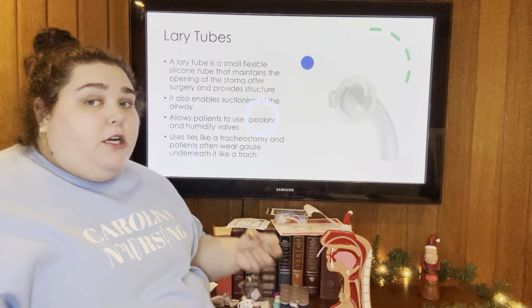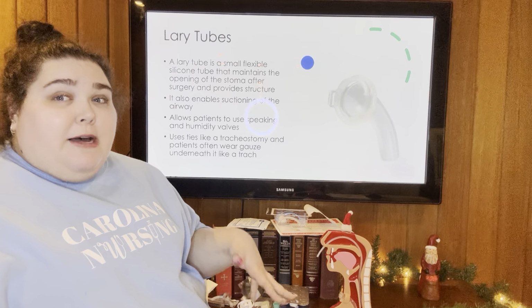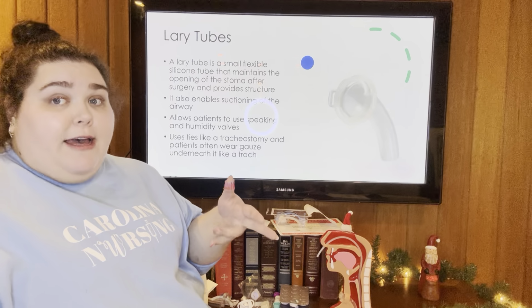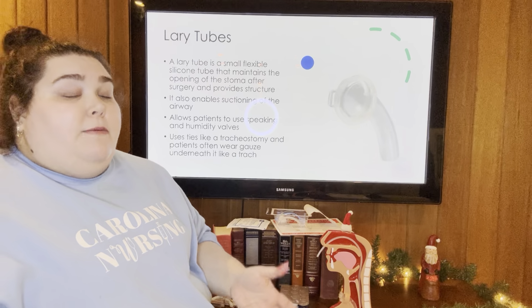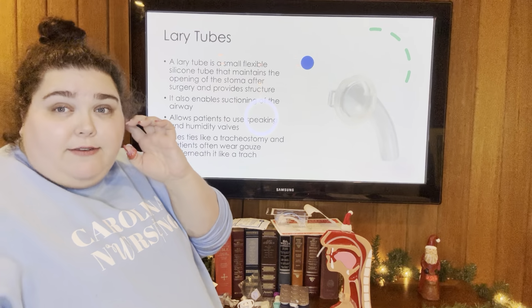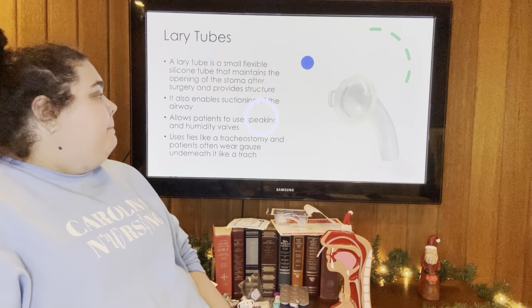The stoma is not going to close entirely, but it can stenose. So we want to make sure that it has a little bit of support to keep it as open as possible. Then it's also going to be to provide a place to put HME valves and speaking valves. So we want the airway to continue to be humidified. So we need some sort of a device that can hold a humidification, so we don't have to have our patients hooked up to a trach collar and hooked up to the wall all the time. So we'll talk more about those HME valves in a little bit as well.